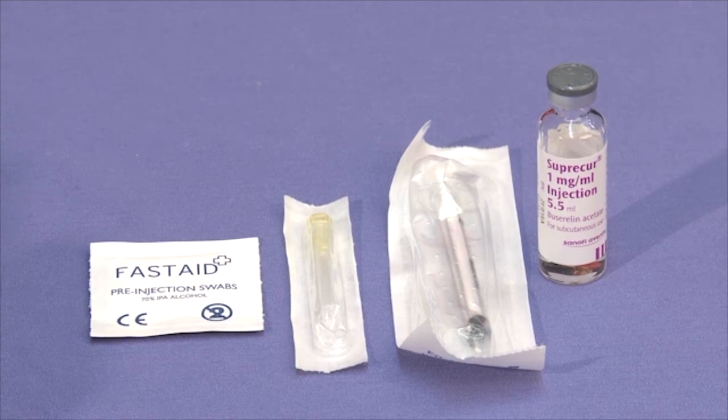You will need one syringe, one yellow needle, an alcohol wipe, and the vial of Bucerulin.